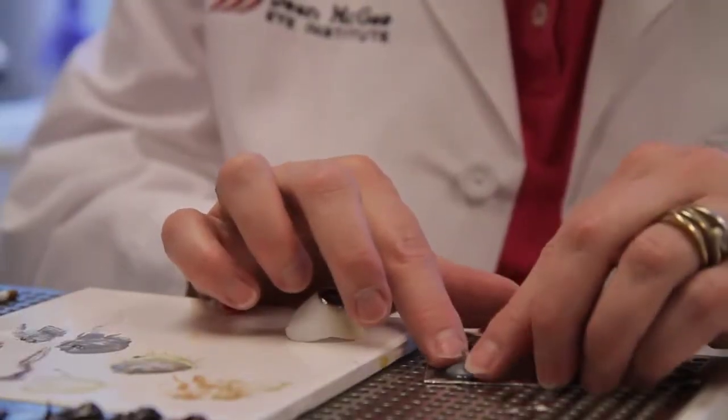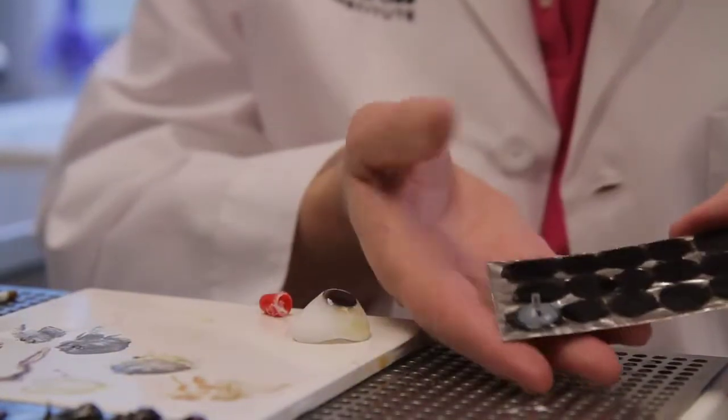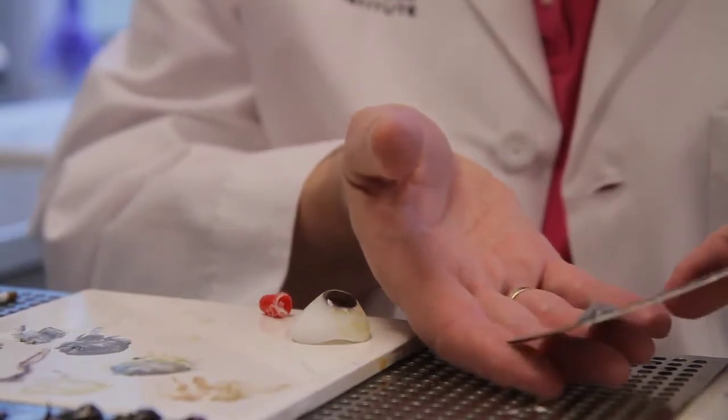I paint the color on this little piece of foil, and then put my cornea on — with the pupil in it — and it shoots the color up.